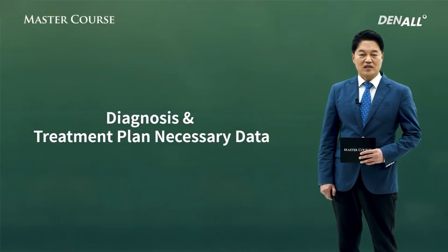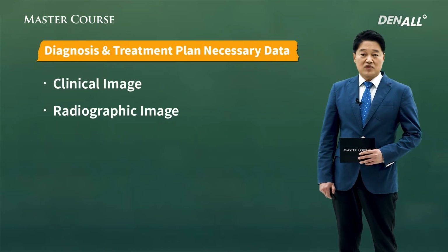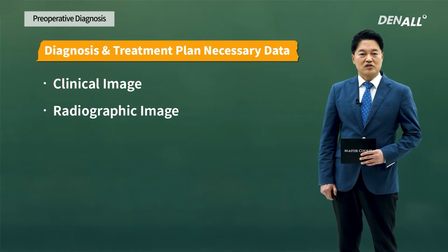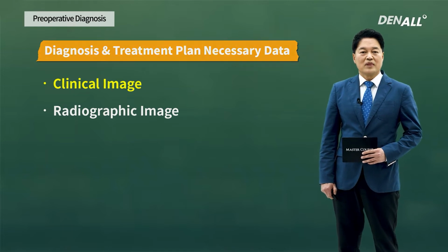Second, diagnosis and necessary data for treatment plans. As mentioned, there is clinical image and radiographic image. I'm going to look at clinical image first.